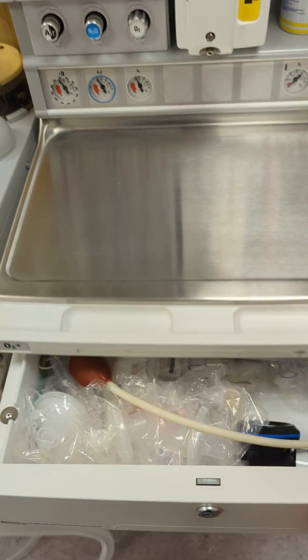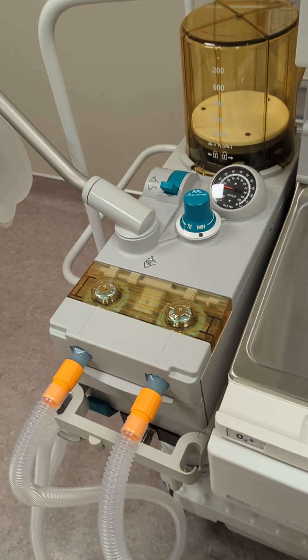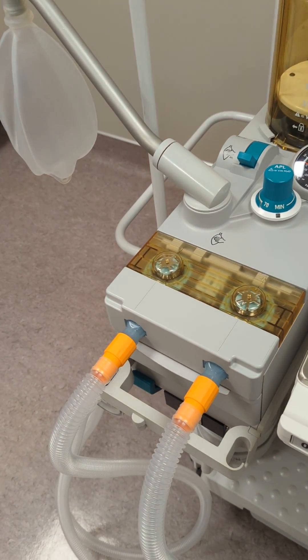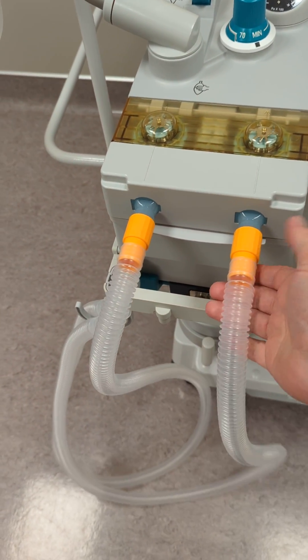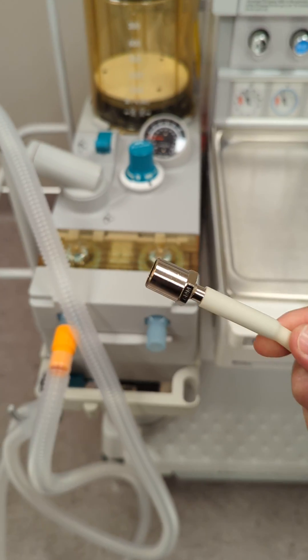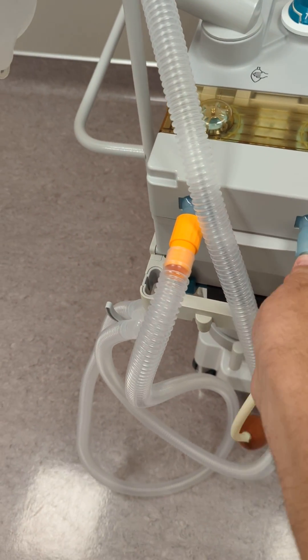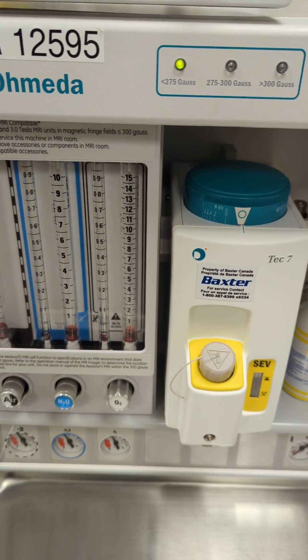So first test, open the drawer, grab your bulb tester. Disconnect the expiratory limb from the system. Insert your bulb tester. Ensure your vaporizer is turned off, as this is the vaporizer leak test.